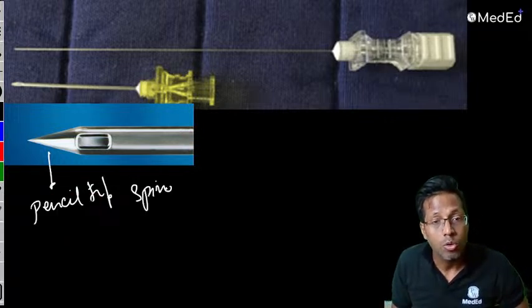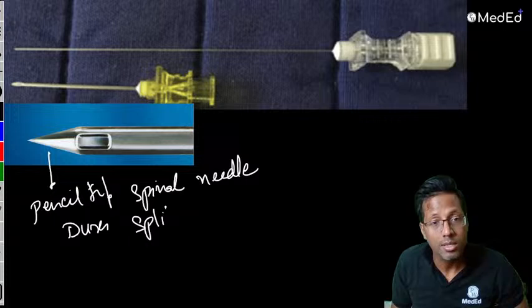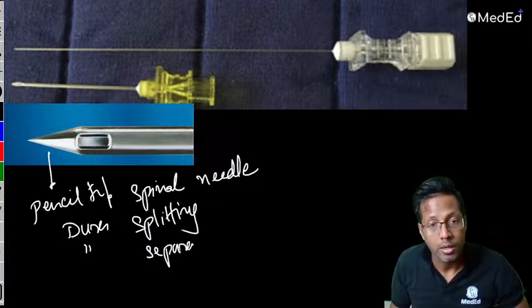All right. So this is a pencil tip spinal needle. So is this a dura cutting? No, this is not a dura cutting. This becomes dura splitting or dura separating. Dura splitting or dura separating.